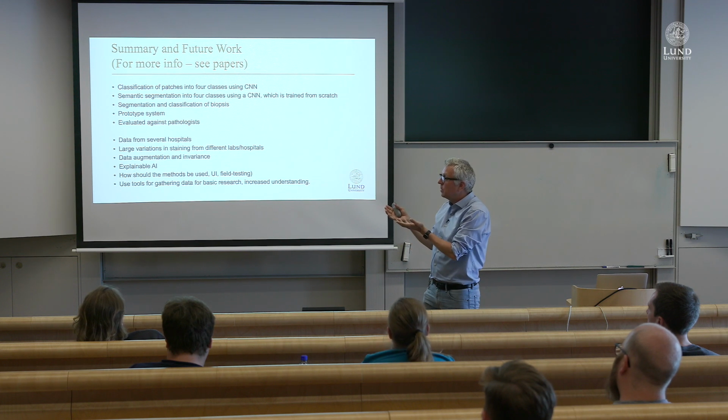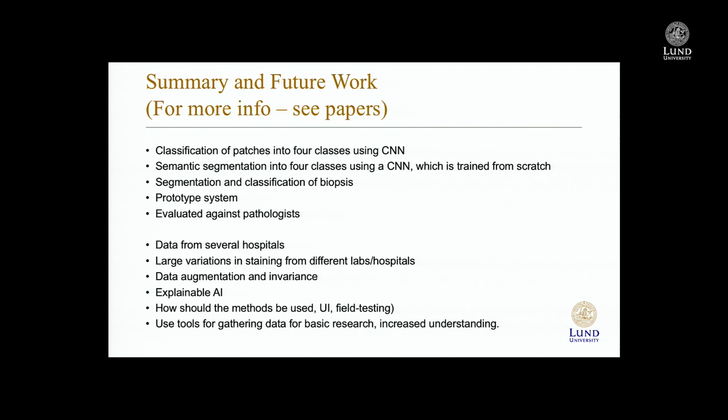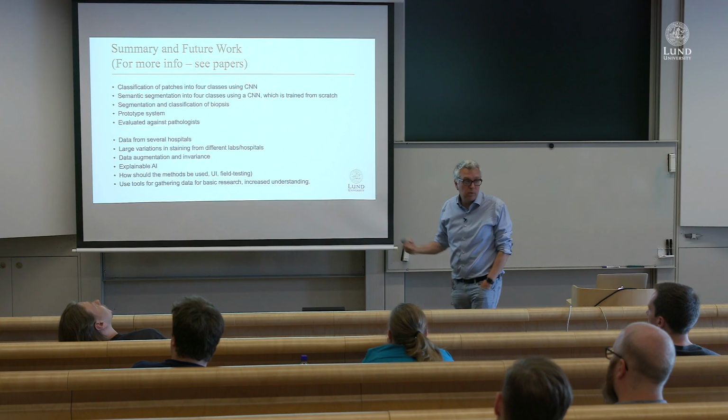We've run into this problem that we have different staining at different hospitals, so that has made us look into these different ways of handling the staining variation. We made prototype systems and we evaluated against pathologists. There is interesting future research here: to work more on this staining normalization, and also to work more on how to explain the results of the automatic system.